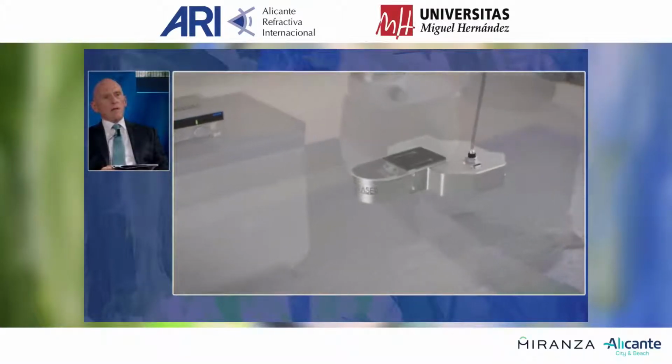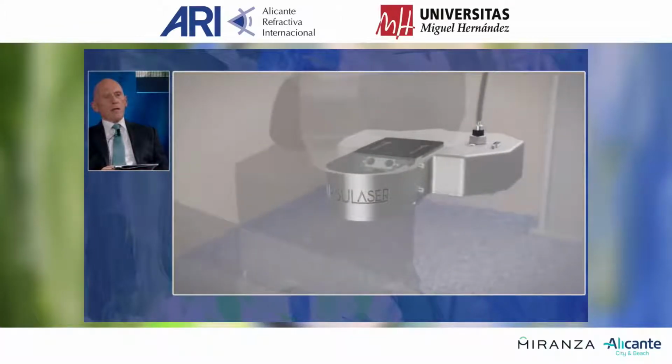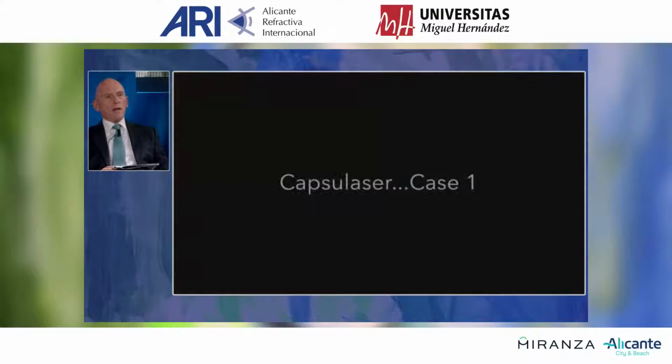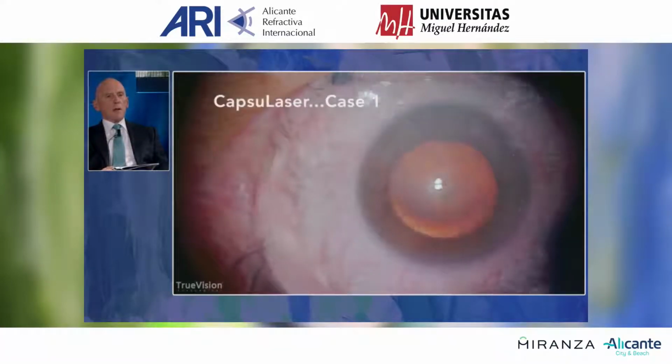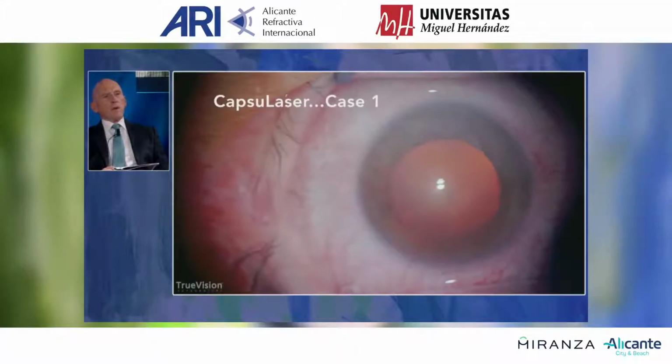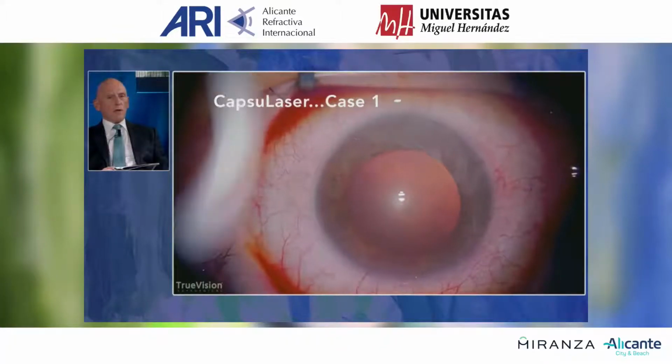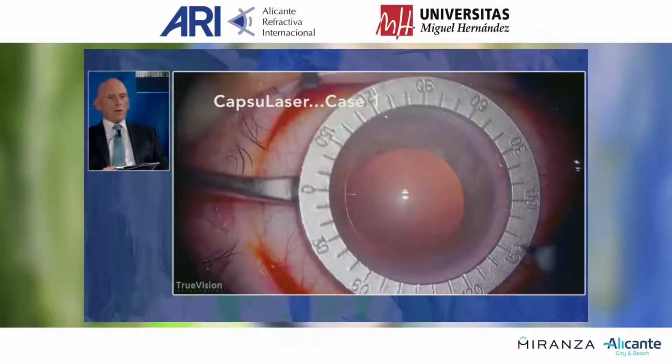This device is engaged to the microscope. It is simple. It's not bulky. It doesn't make the microscope heavier, and you can manipulate the microscope as before. This is one of the cases that we did last Monday. I'm talking about last Monday, and today is October 29, 2021.